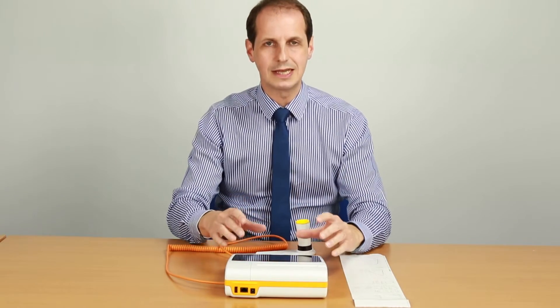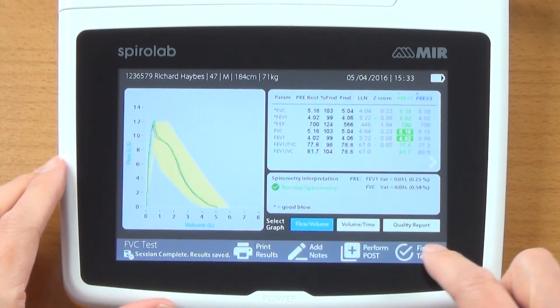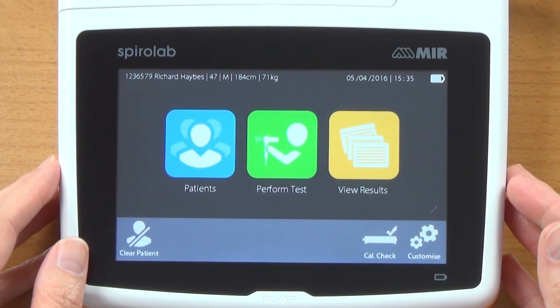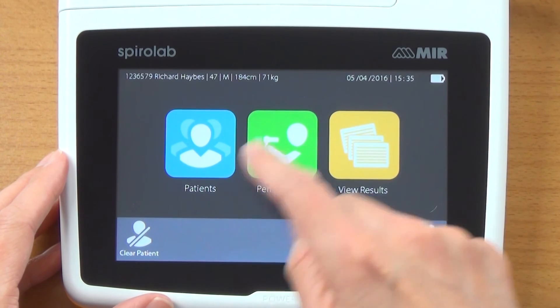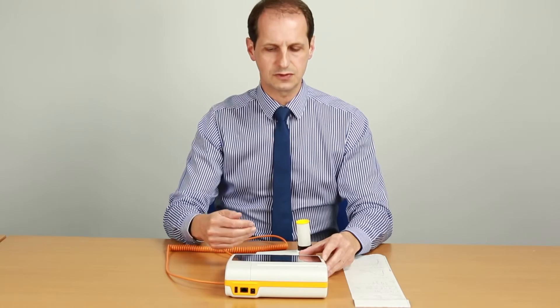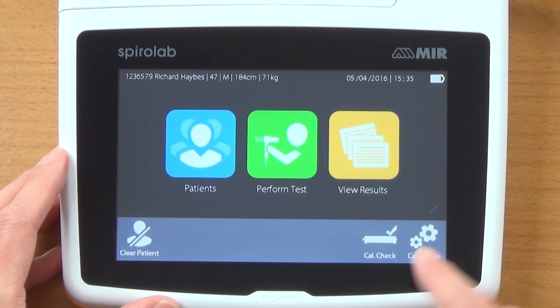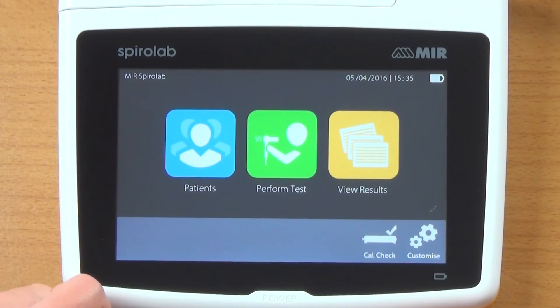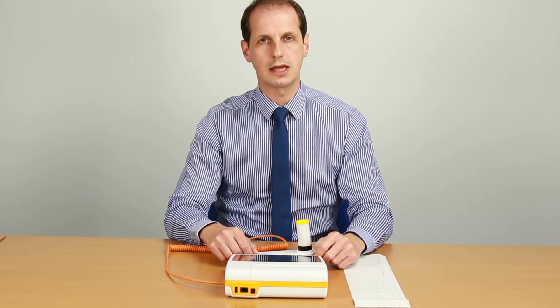Now we've finished the testing on the spirometer, we can just click on finish test and we're back to the start again. You can view the results for that patient, and if there were multiple tests you could view them all. The other options down the bottom are for the calibration check using a 3 litre syringe, and you can also customise the device. If you want to clear the patient, it's now cleared and we're ready to start again.